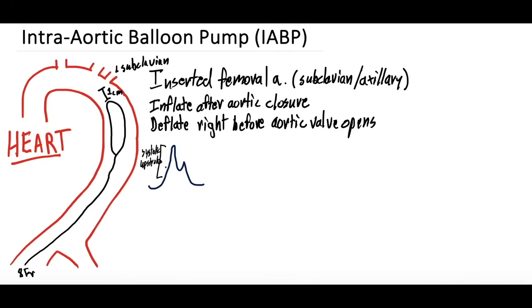The systolic upstroke is the increase in pressure that occurs in systole when the left ventricle contracts and shoots blood out of the ventricle. This portion here is the systolic downstroke. You can see an elevated pressure above baseline, but the pressure is starting to decrease because systole is getting towards its end. The pressure is coming down even though you're still in systole and the left ventricle is still contracting. Less blood is coming out and thus less pressure is being created.